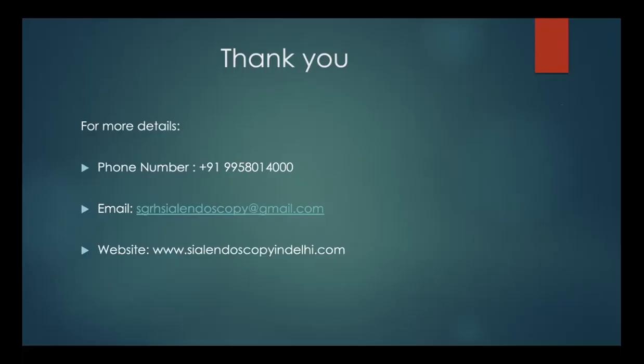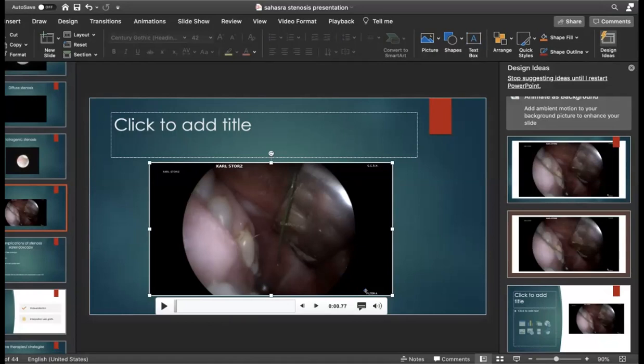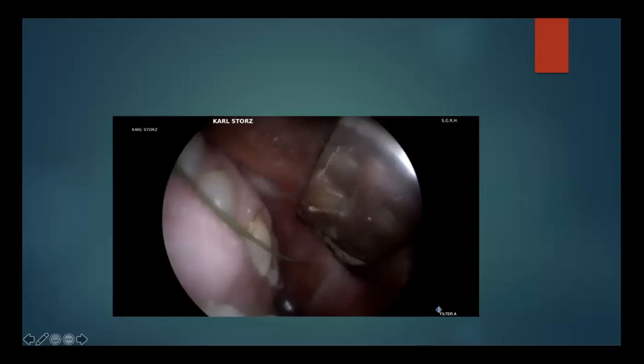Right, so I'll just share the screen again. Okay, so this is a video. This is the same video that I was intending to show earlier with the papillary stenosis. You can see the guide wire which is inside the duct. Yeah, we can see it. Okay, so I'm just going to play that.